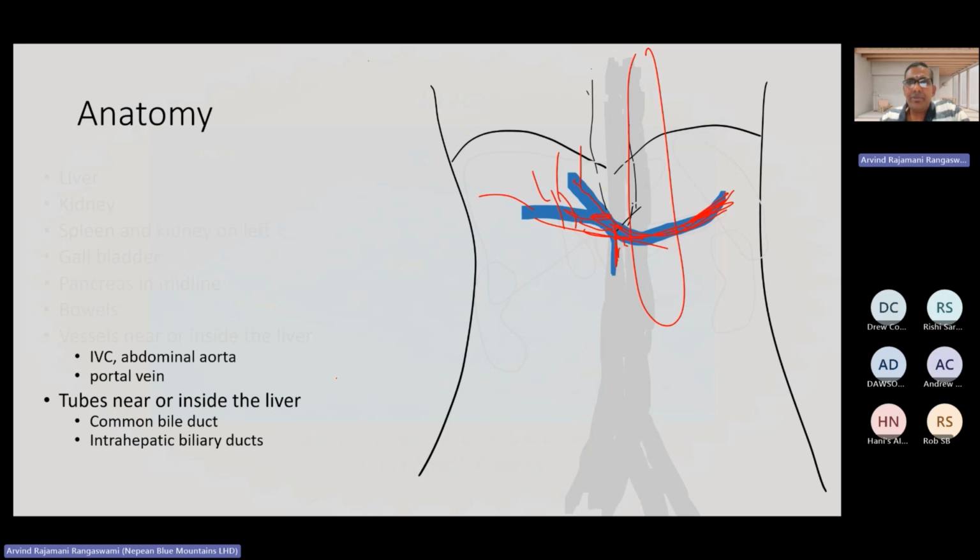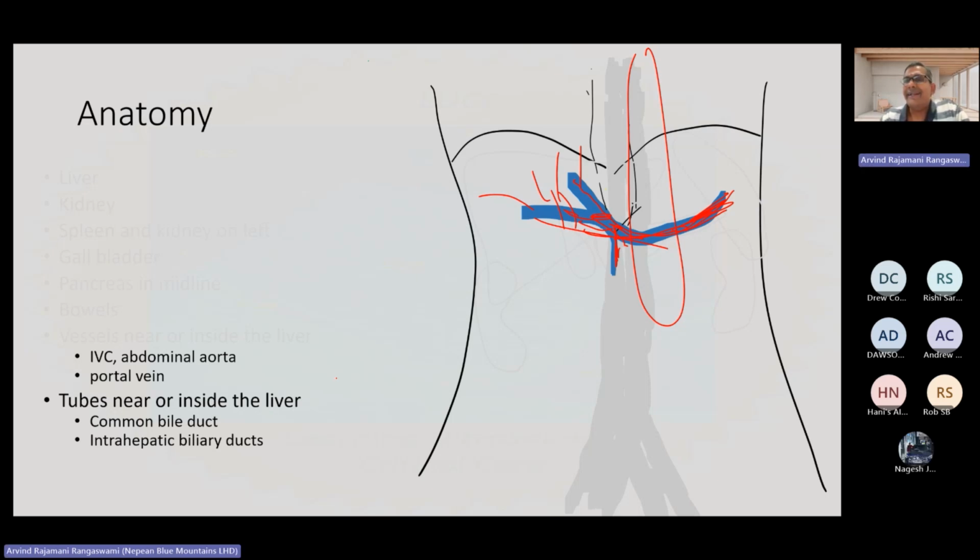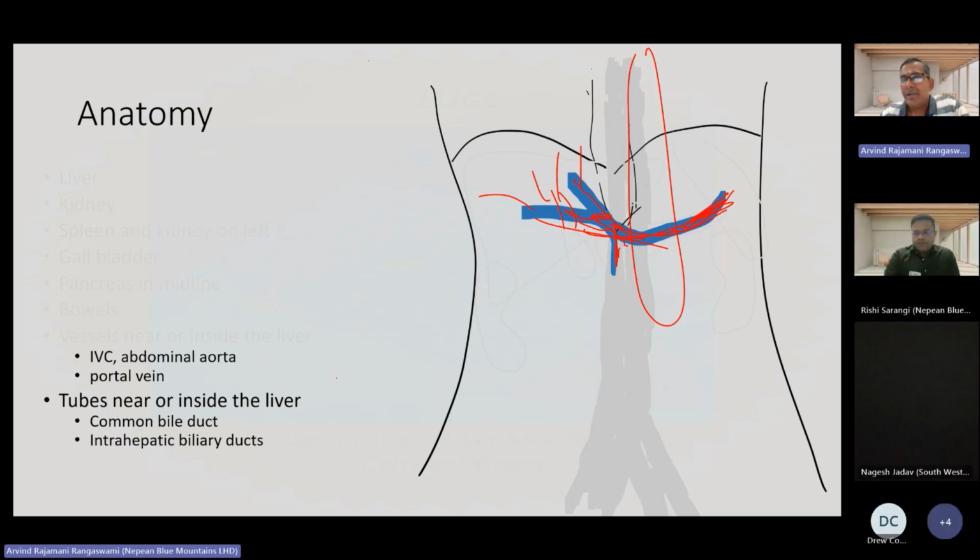On the other hand, the abdomen is something that we deal with every single day, and this anatomy is intuitive, and ultrasound and CT scan, for that matter, any imaging, is all about the anatomy. And for that reason, in my opinion, ultrasound of the abdomen is a skill that is super easy to learn by any clinician who is well versed in the anatomy.